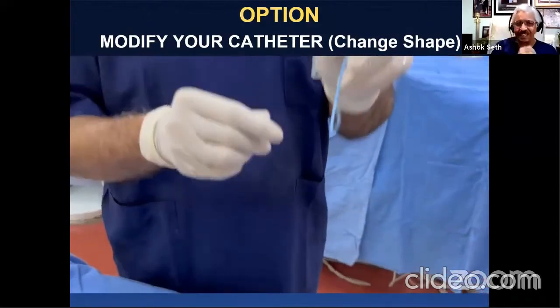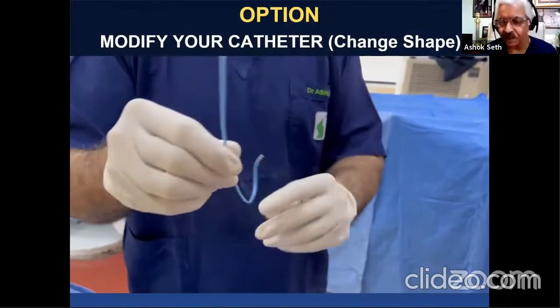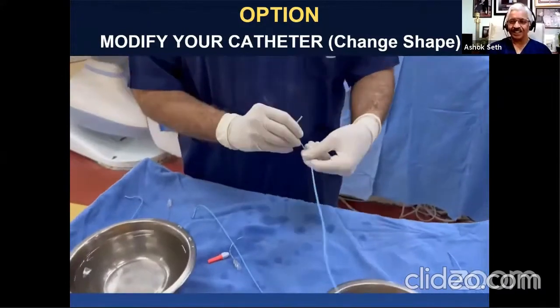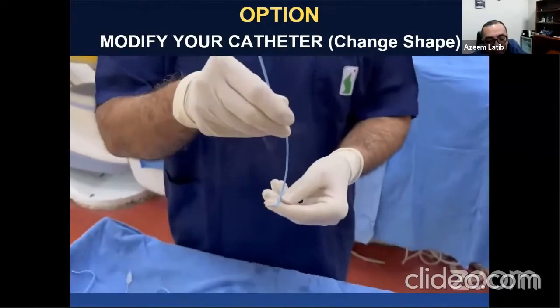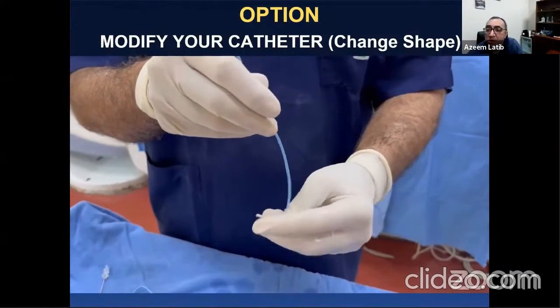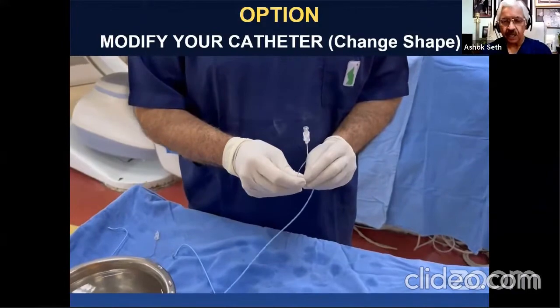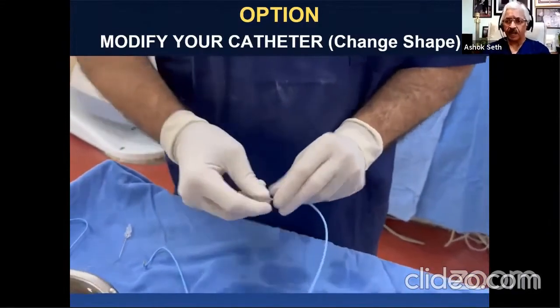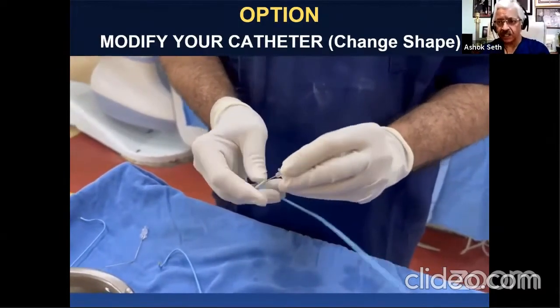So this technique has the versatility of doing anything and changing the shape of any catheter. Go ahead, Azim. No, it's amazing. Like I said, it's just so simple that I like this. Does it work with guiding catheters? Yes, this is a guiding catheter, a 7 French guiding catheter. All this is with 7 French guiding catheters. I prefer 7 French because it retains its shape better in blood. The 6F behaves more like a diagnostic catheter and loses its shape much earlier.